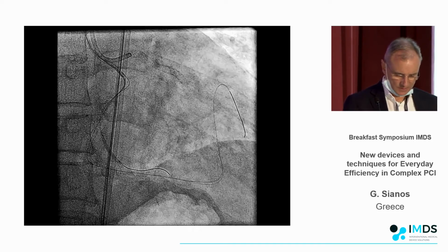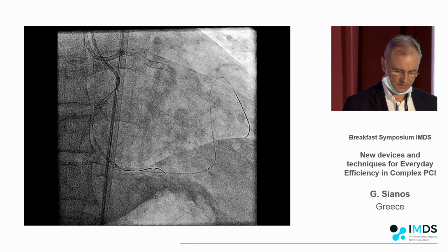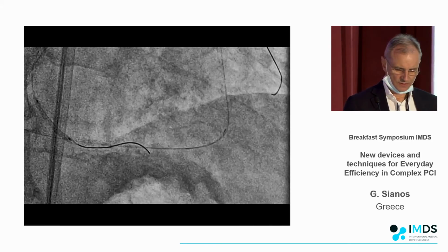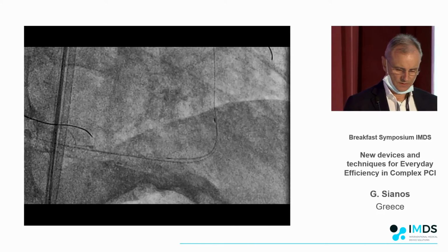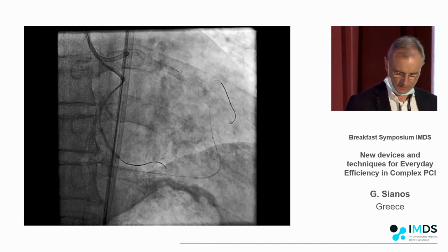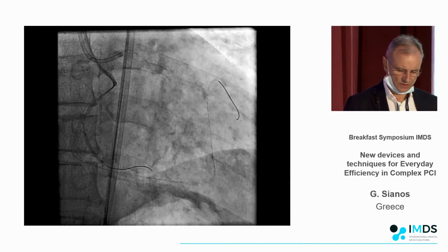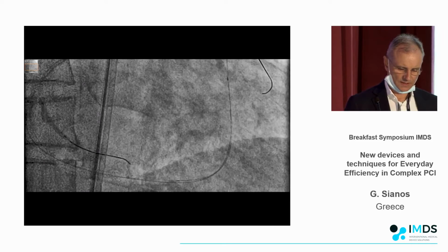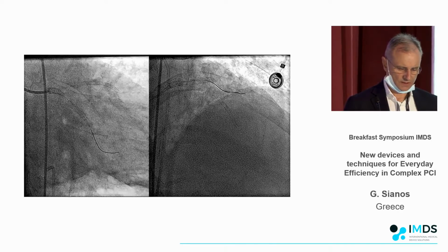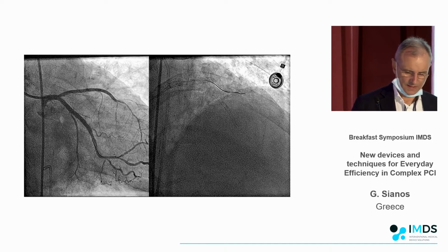That's how a balloon, if the patient is a little bit lighter, you can appreciate that you can see the device here. You see the marker that's going up. There is some resistance there. You see it in a close-up as it works here. And then by continuing to push, you see that it makes a quick move forward, and then it's crossing. And with the dottering effect, there is no dilatation here. It's not necessary. You see it here. This is a classical way. The balloon is crossing, and then the microcatheter is easily following, as you can appreciate. And the case was concluded by reverse wiring through the stent.